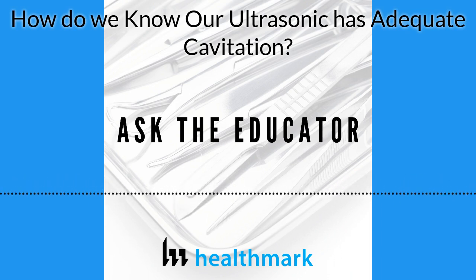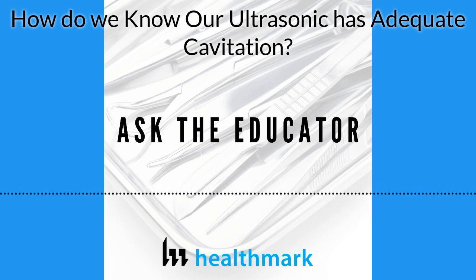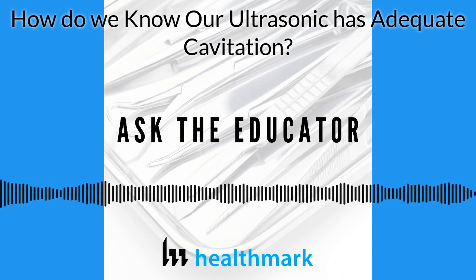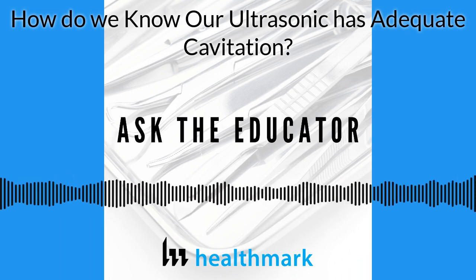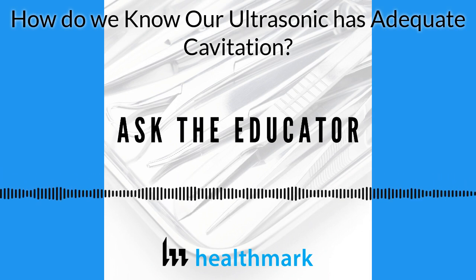And that's why many of these don't have a lot of data behind them, because I did show that many of these tests that say they show cavitation, I can show when there's no cavitation, they get completely clean. So people are getting a mixed signal. So we must remind people to start looking and thinking of quality management systems.